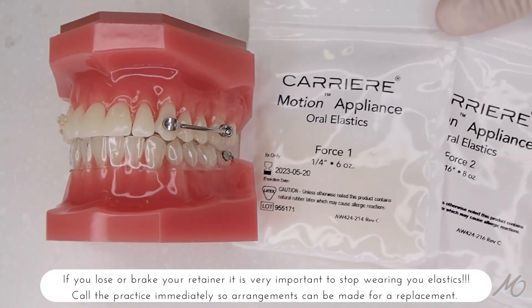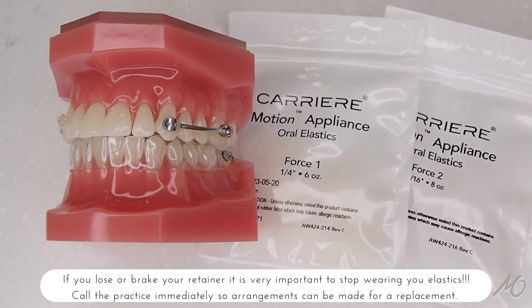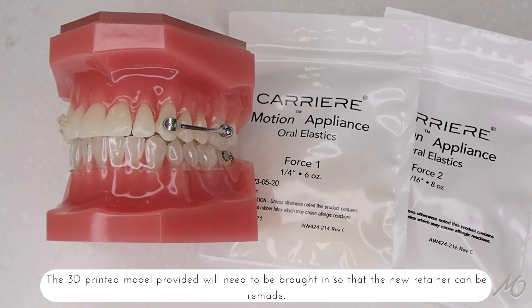If you lose or break your retainer, it is very important to stop wearing your elastics. Call the practice immediately so arrangements can be made to make you a new one. The 3D printed model provided will need to be brought in so that we can make new retainers.